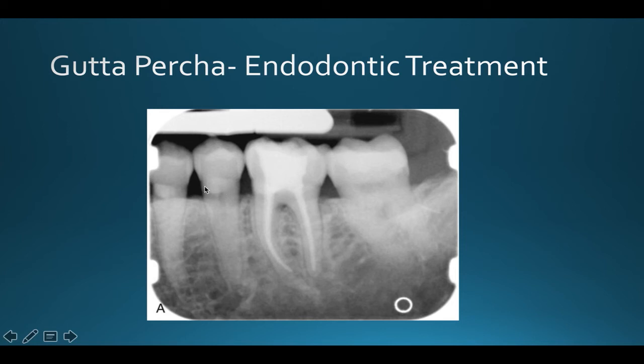And then here on 20 and 21, these are important to notice as well. Do you notice we have these buccal class 5 composites on tooth numbers 20 and 21? We probably had either some root caries here, or maybe treatment for some abfractive lesions. We can assume they're on the buccal surface, even though we can't tell buccal or lingual, because typically that is where you're going to see composite restorations such as these, in the buccal class 5. So make sure you're looking out for things like this when you're looking at radiographs. They're definitely easy to miss.